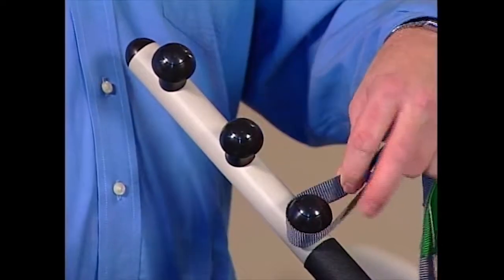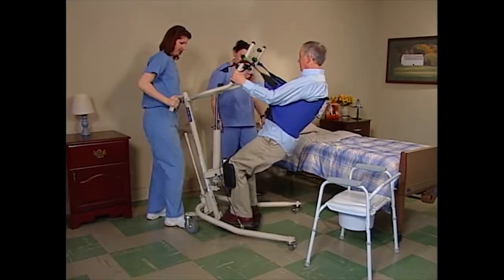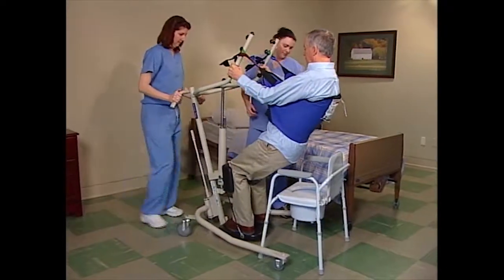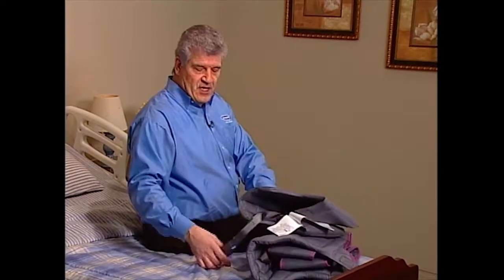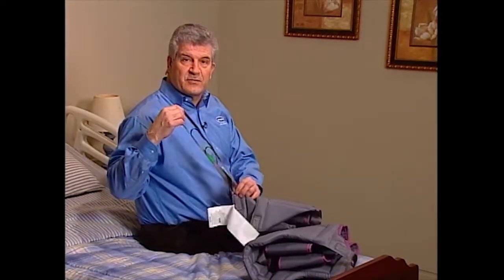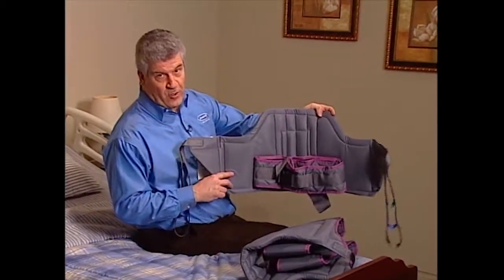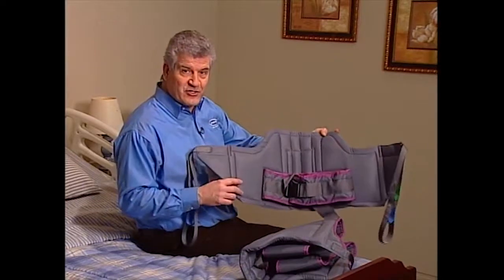Although one lift works for multiple residents, it's recommended that each resident be issued their own individual sling that corresponds to their size, medical condition, and the type of transfer required. Invacare slings are constructed of soft, durable solid fabric with padded areas for extra comfort. They feature multiple hookup loops so they can be adjusted to the resident's body size. Standing slings are for residents who have both neck and head control and can support the majority of their own weight — they provide support from around the torso.